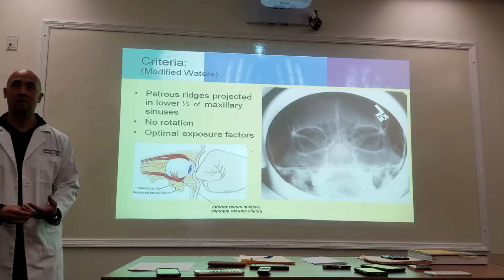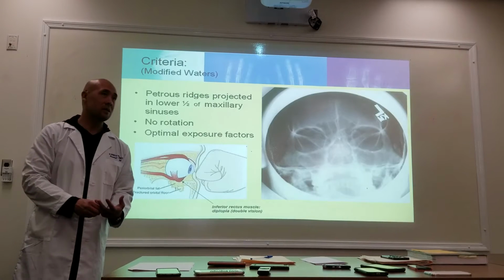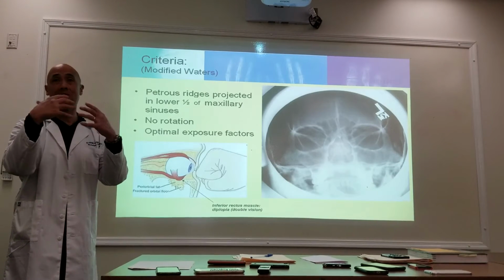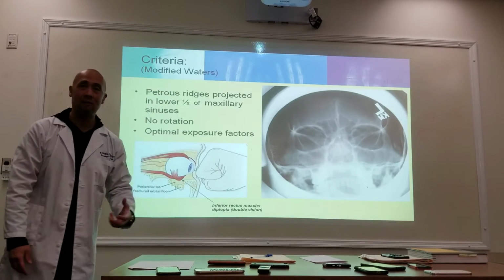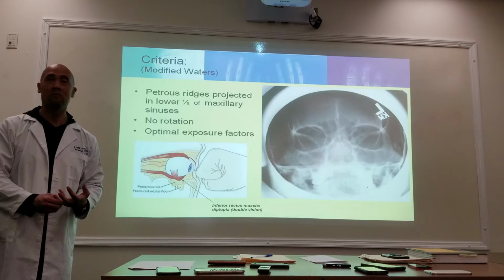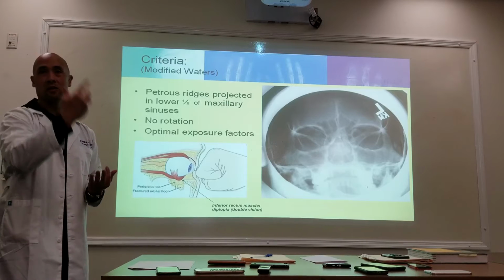You don't. The cylinder cone we used almost predominantly for head studies, and since the advent of the hard technologies of imaging, they got rid of that because we can get good detail now just simply collimating all four sides. But the whole purpose of this was that it gave us optimal visualization of the study because it was a true beam limiter in absorbing scatter radiation. It was a really true beam limiter. So absorbing scatter radiation and improved contrast, which also improved the resolution of the image. But we don't need that anymore because of our digital imaging.